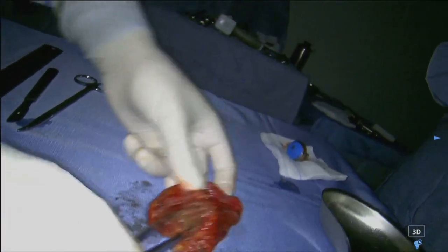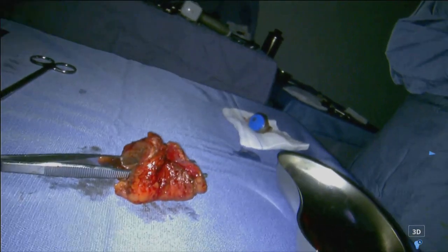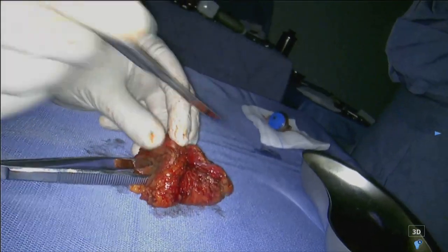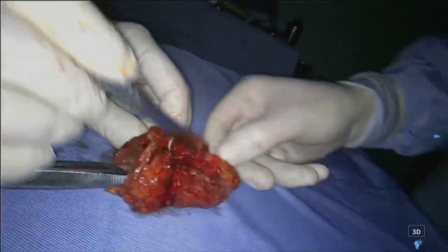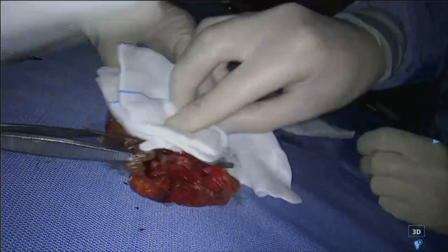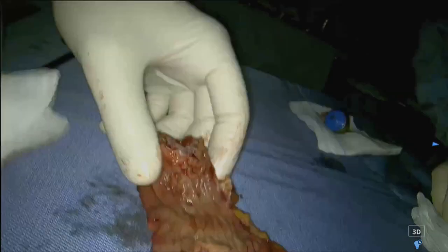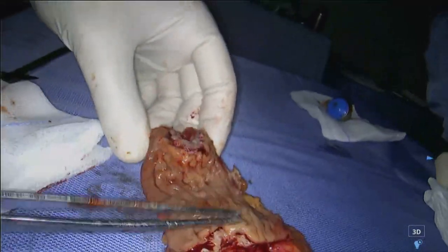So if I go like this to open, you know that the characteristic of this bowel nodule is that the infiltration of the mucosa is very rare. So I cut in the middle part of the nodule, arriving at the mucosa. Okay, and I am exactly in the middle. So you see that the integrity of the mucosa is perfect. There is only retraction here of the mucosa on both parts.